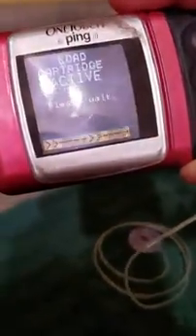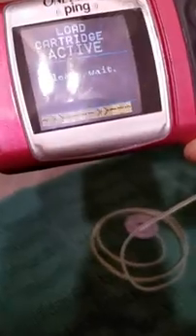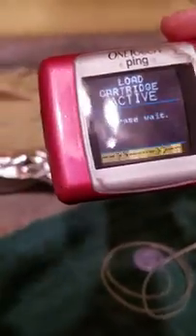And you want to make sure you didn't put a ton of insulin, because we usually have to change the site every 2 days. So it is Thursday. We'll probably change it again Saturday. And we will film that because we've only filmed the CGM one. So now you're going to see insulin. So 121 units is what we need for 2 or 3 days.